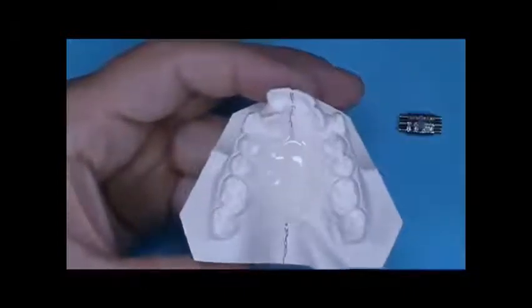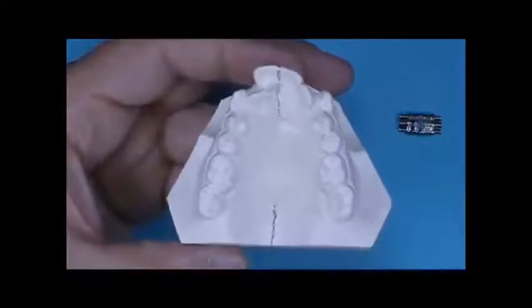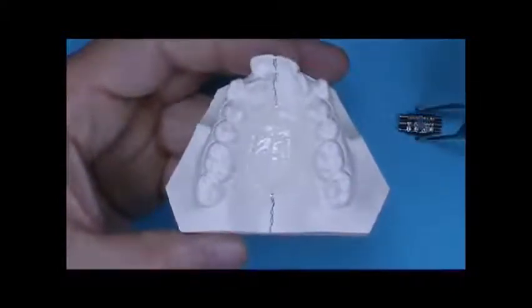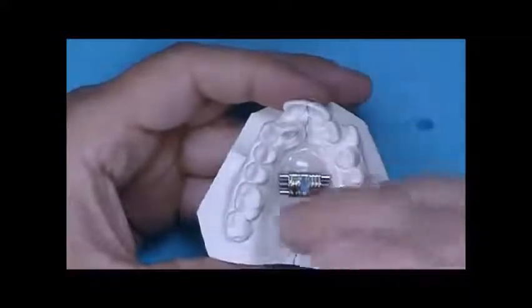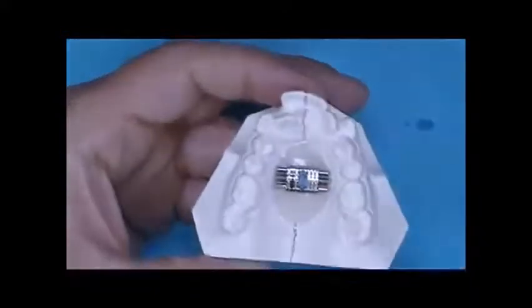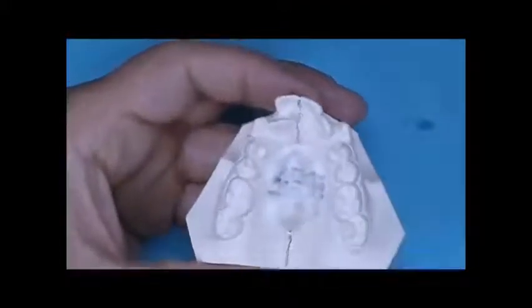Apply a light dusting of polymer powder to thicken resin foundation. Then place expansion screw onto resin buildup with expansion screw arrow facing heel of model. Align center opening of screw with middle of palate and top to occlusal surface of right and left sides of posterior dentition. Stabilize screw by adding a few thick layers of resin. Finish with polymer powder.